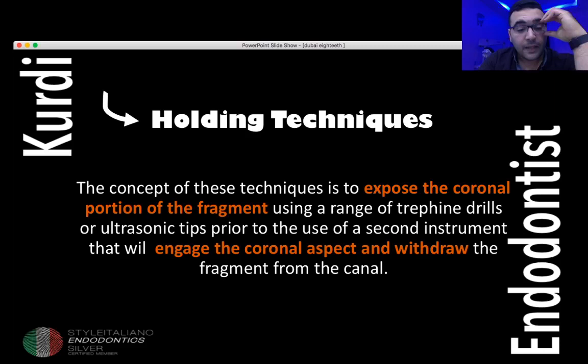The holding technique, the concept of this technique is to expose a little bit of the coronal part of the fragment and use another instrument to remove the file.